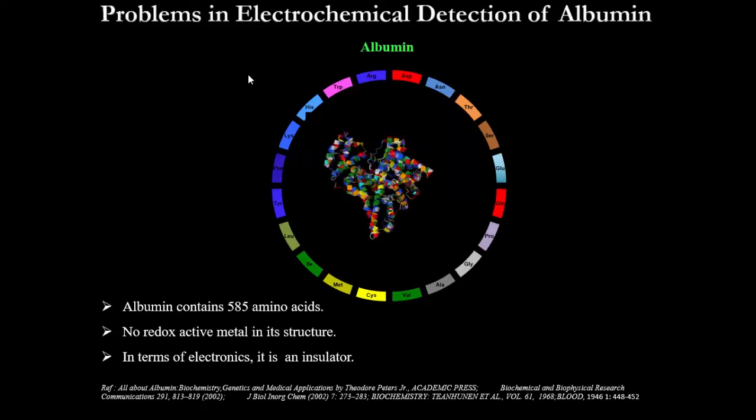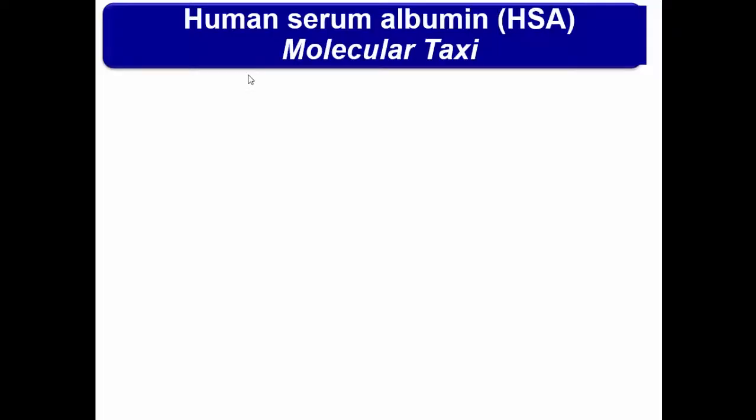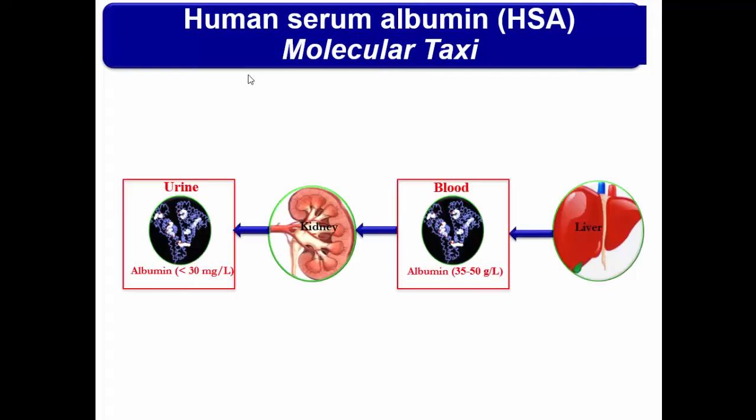And that is why you do not have any electrochemical point of care albumin sensor out there, right? Okay, and that is how you start worrying about these problems. We call all our sensors physiology inspired sensors. We have sort of learned from what happens in the human body. We started asking the question, okay, we understand albumin is an insulator, but can we learn from physiology and do something?